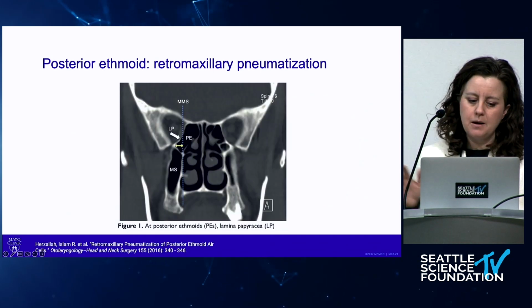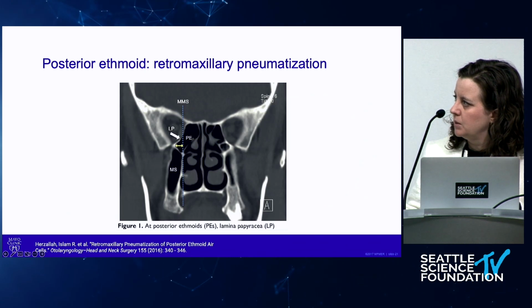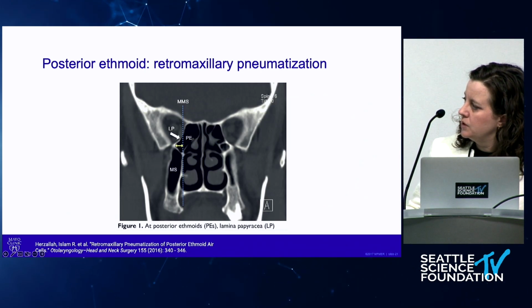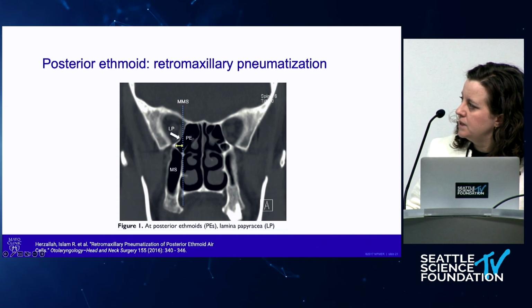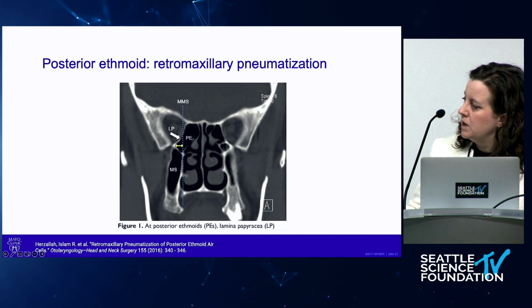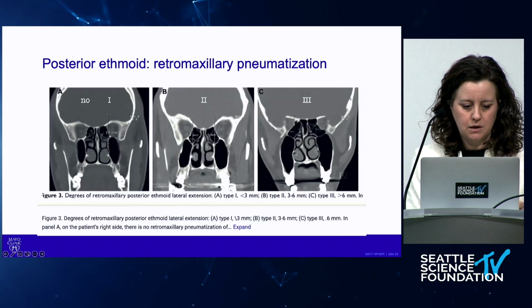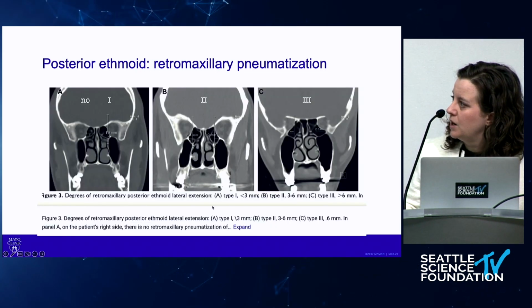There may be some variations in the anatomy, and one thing to watch for is that some of these posterior ethmoid cells extend pretty deep inferiorly. You want to make sure you open up those cells completely. Look at your scan, see your orientation or your configuration of your orbit to your maxillary sinus. It can vary quite a bit.